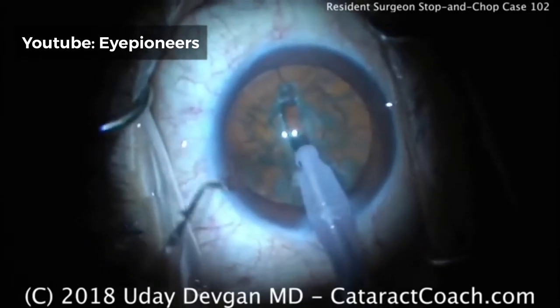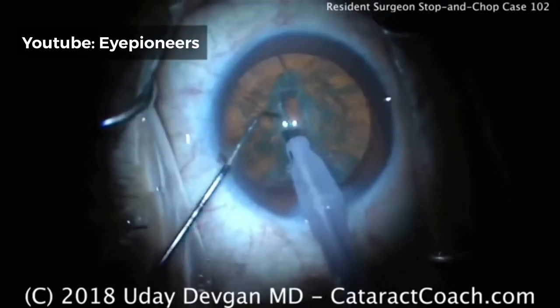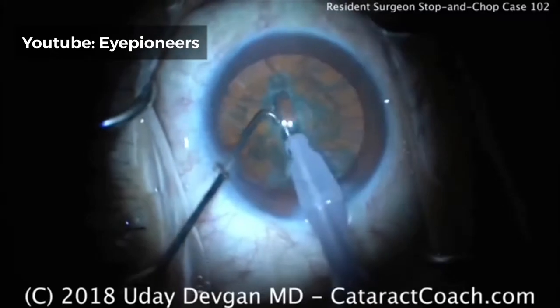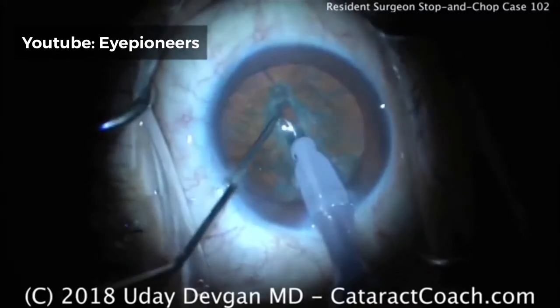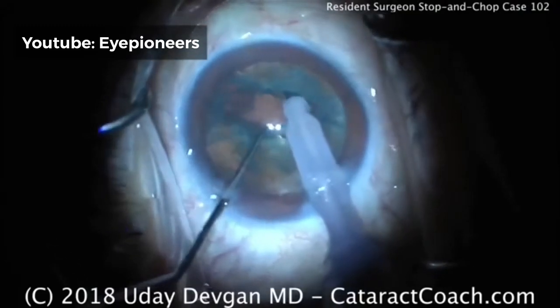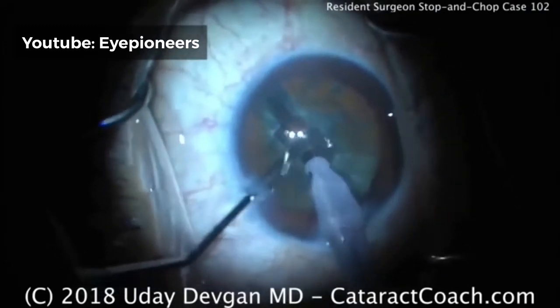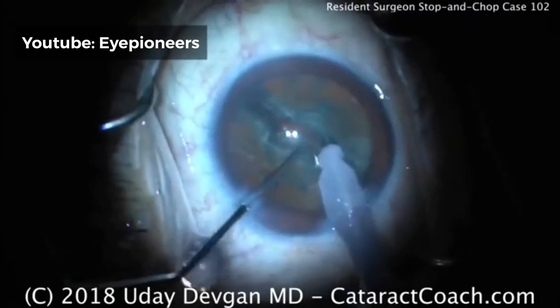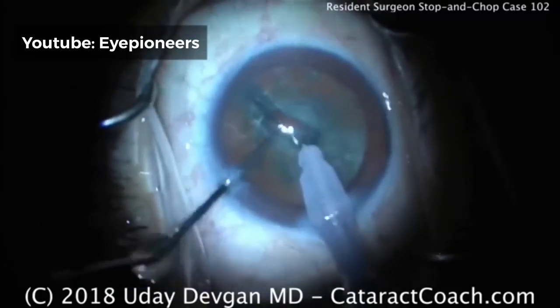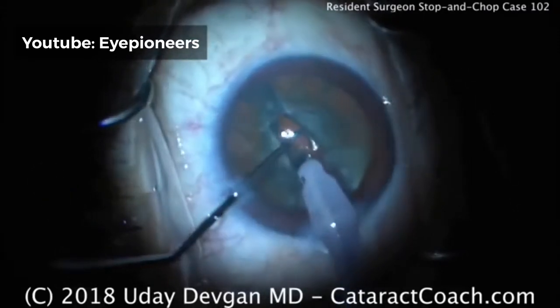Putting the chopper in the eye — put both instruments deep within the groove. Let's see the split. That's excellent. Notice how the lens is cracked into two halves and care is taken to make sure there's full separation of both halves — really make sure it's separate. That was the last holdout sub-incisionally.